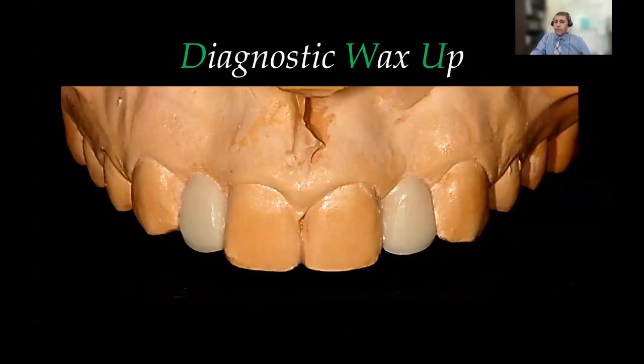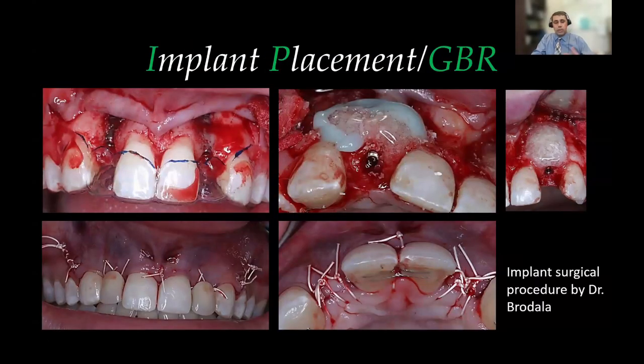So I planned a diagnostic wax up so I can see where I'm going with the case before I start. It's prosthetic driven planning and implant placement. Now I can know where the gingival zenith of the prospective restoration is. I can give my surgeon, in this case, I did not place the implants, but Dr. Nadine Brodala placed those implants, and we will go about 2 millimeter palatal to the gingival zenith, about 3 millimeter in depth, and place the implant where it actually needs to be from a prosthetic standpoint.